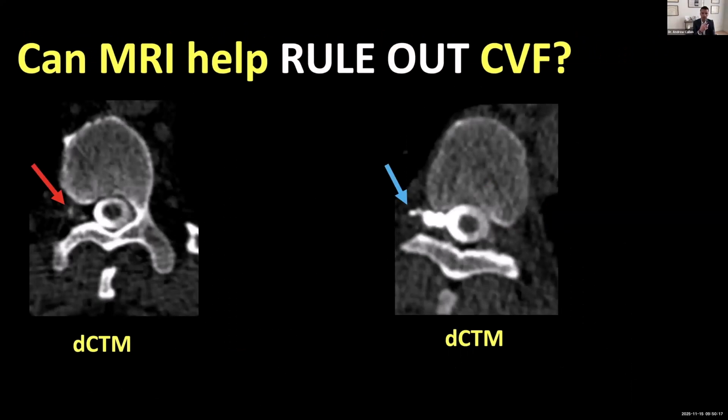Now, we've kind of talked about the fact that CSF venous fistulas don't have epidural fluid collections. And so, is there any utility at all in using MRI? Once we've said there's no collection, do we just sort of forget about the MRI? Well, I think that they can help, and they can help when we're looking at our myelograms. And they can help in two sort of ways.